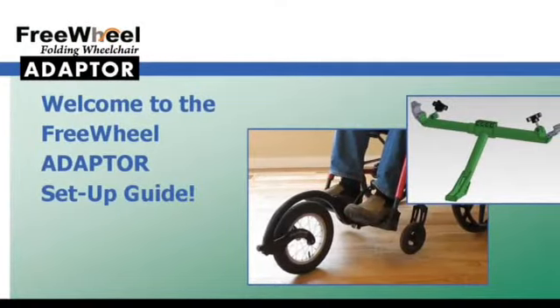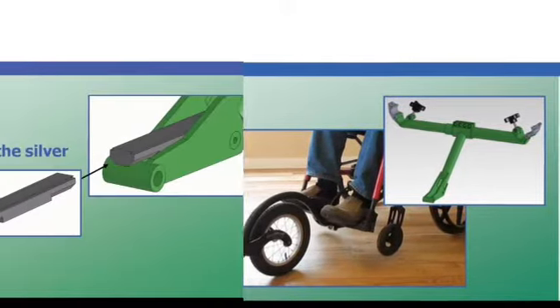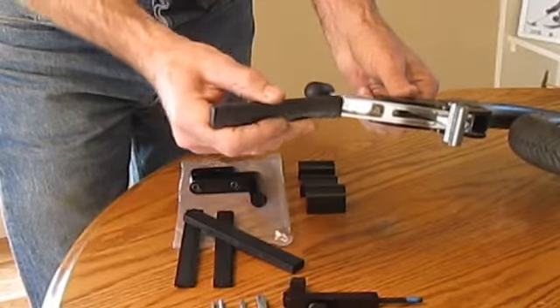This adapter setup guide video will take you through the steps to set up your FreeWheel and the adapter. The first step is to set up the straight shim on your FreeWheel and insert the shim into the silver brick on your FreeWheel.